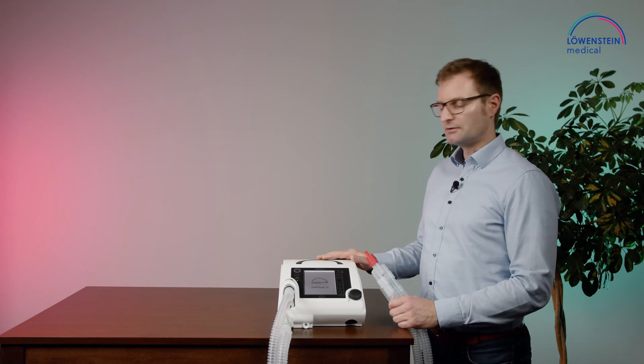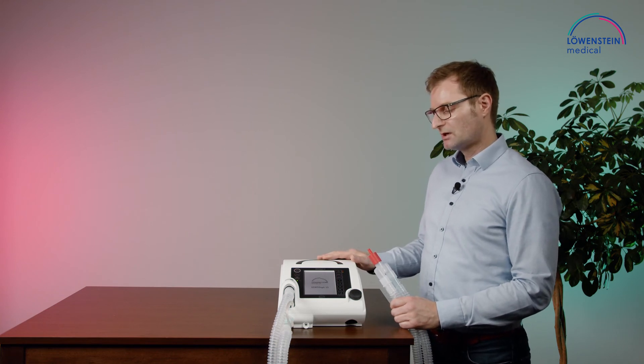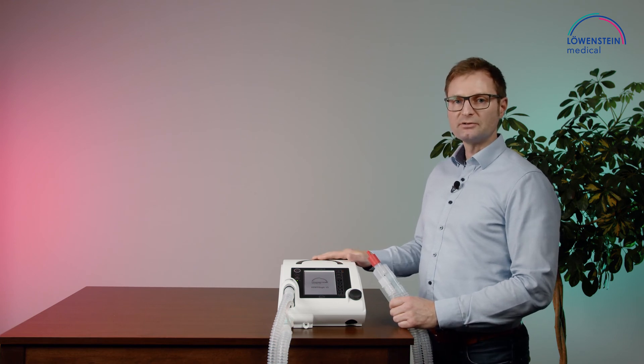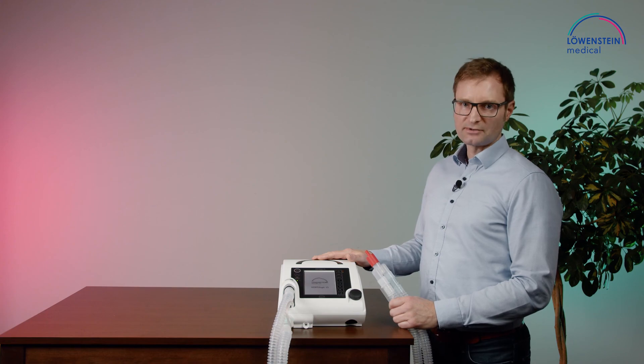In addition, there are a few things more to do, like checking the battery and LEDs and so on. Please look into the user manual and follow the instructions.